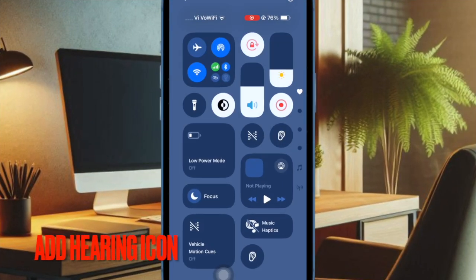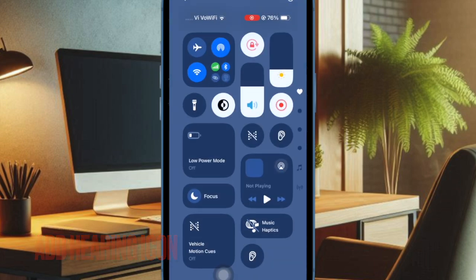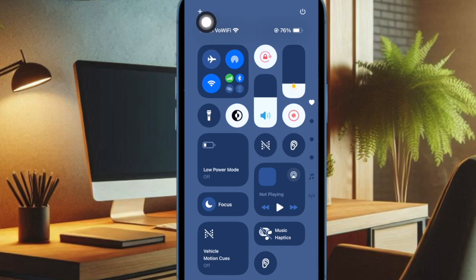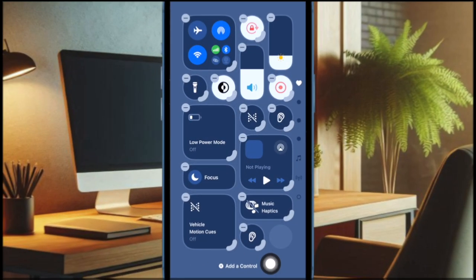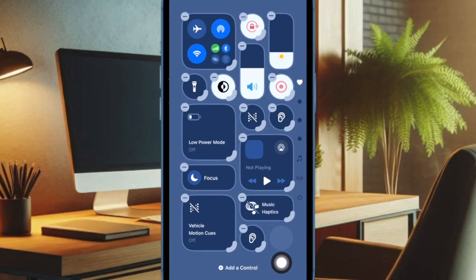To do so, swipe down from the top right corner of the screen to access the Control Center, then tap on the plus button located at the top left corner of the screen. Then tap on the Add More Controls button at the bottom.